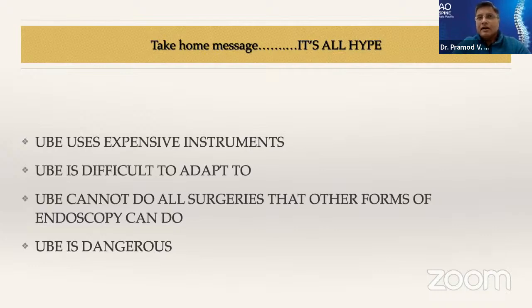So I understand that definitely it is there, and it is a step between tube and full endoscopy. But there are certain marginal areas where tube endoscopy or full endoscopy definitely scores, especially the thoracic spine and the transforaminal approach which you get with it.